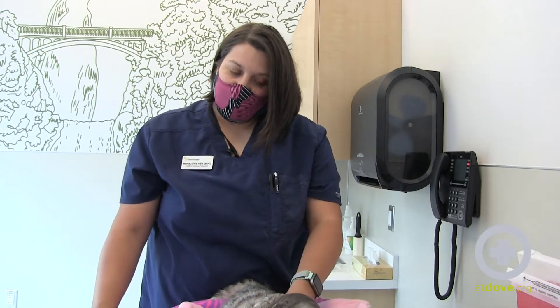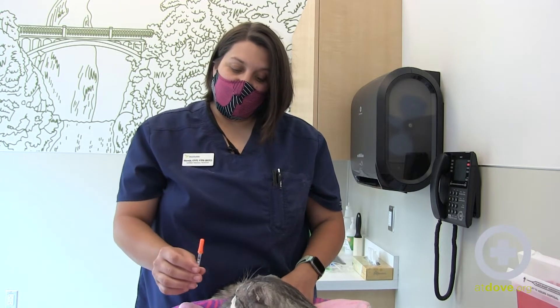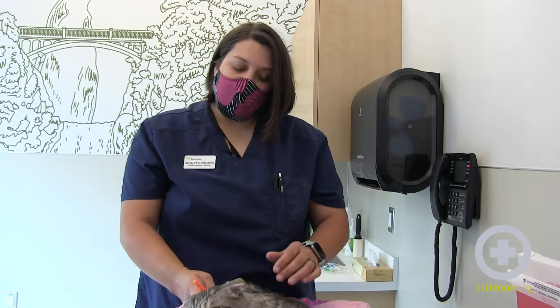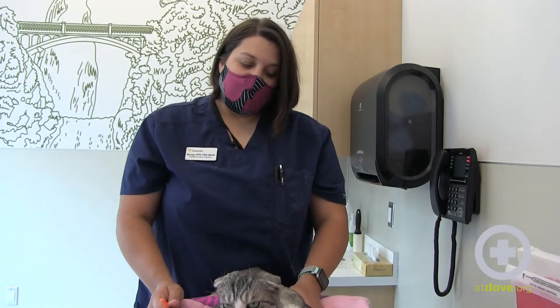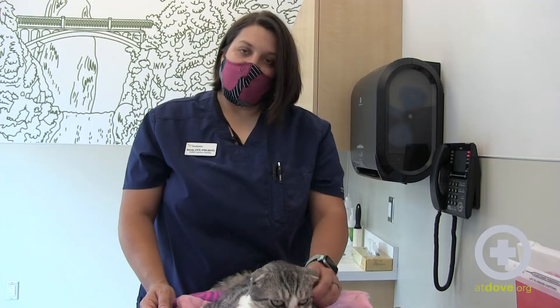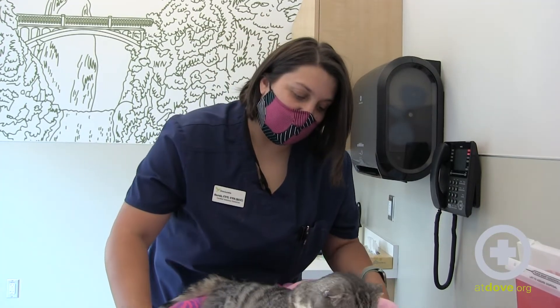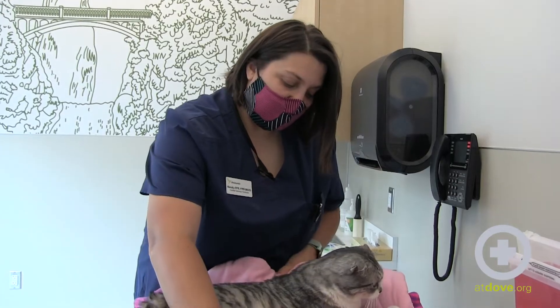There's a separate video on how to read an insulin syringe and draw the medication, but I have Vivian's insulin here and we're going to be injecting it subcutaneously, which just means we're going to inject it underneath the skin.